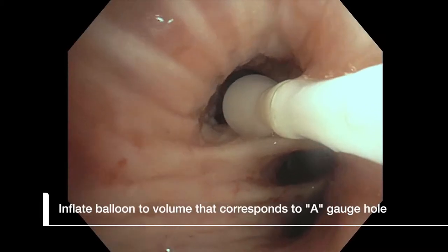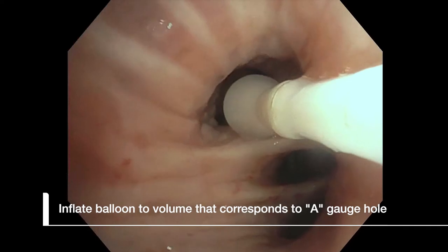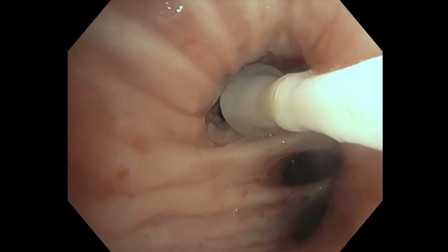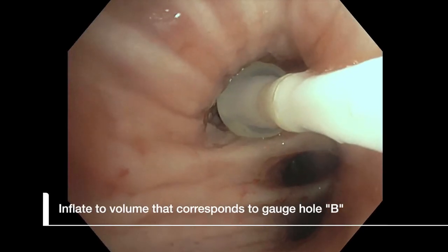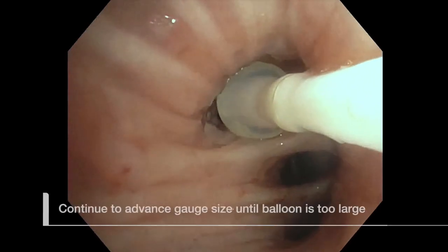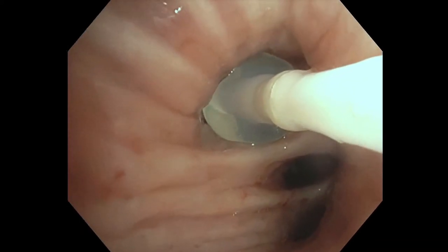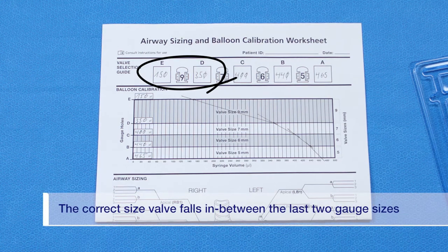Inflate the balloon to the volume on the syringe that corresponds to the A gauge hole. If the balloon, when inflated to the A gauge size, does not fully contact the entire circumference of the target site, inflate the balloon to the volume that corresponds to the B gauge size. Continue advancing to the next larger gauge size until the balloon is too large or wedged in the airway. The correct size valve falls in between the last two gauge sizes.